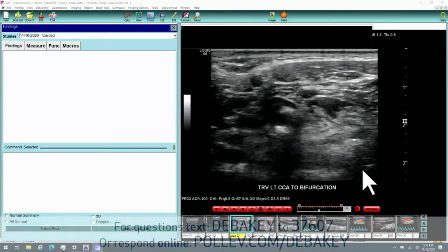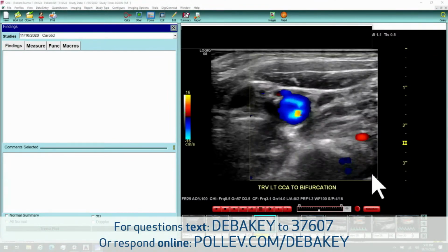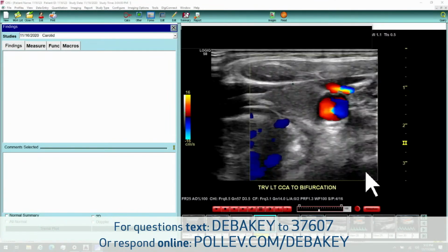All right, going over to the left, what are we gonna see? Oh, excuse me, sorry.